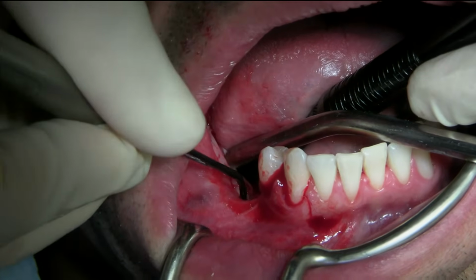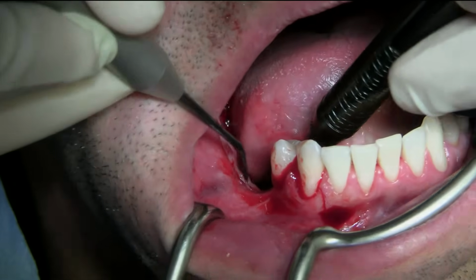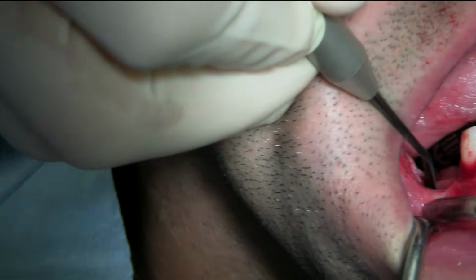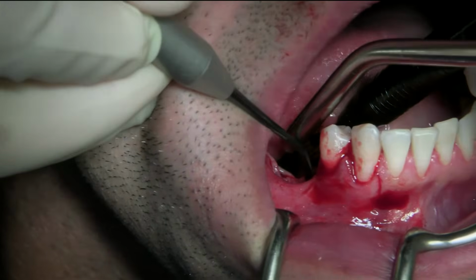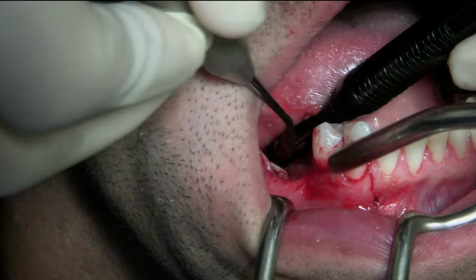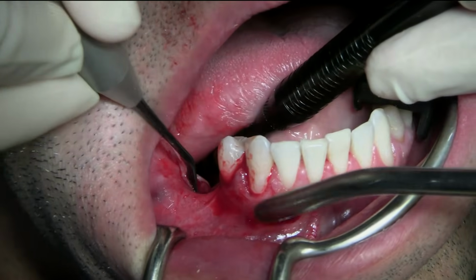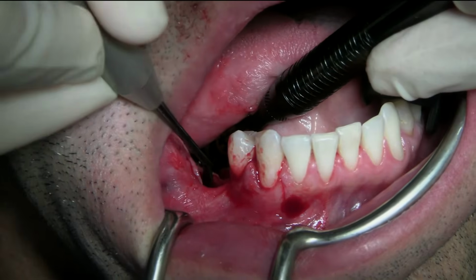What's going on here? Lingual is starting to loosen up. Go a little bit to the left. Which way? This way? Yes. Okay, I'm lingual. I have released the flap. I'm still full thickness, so that's good.